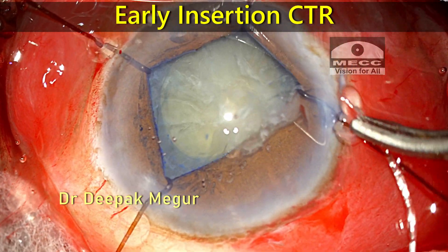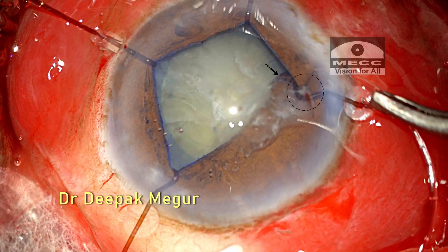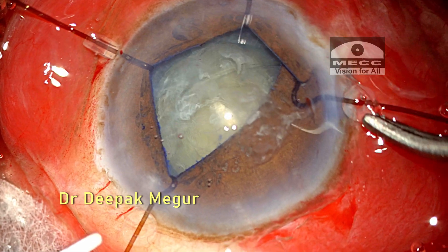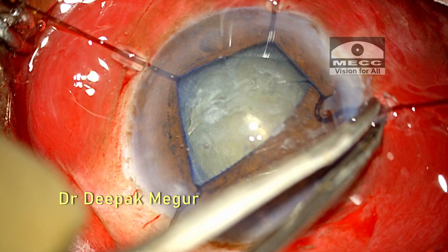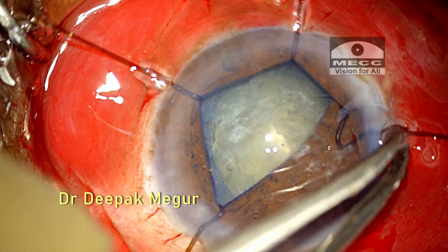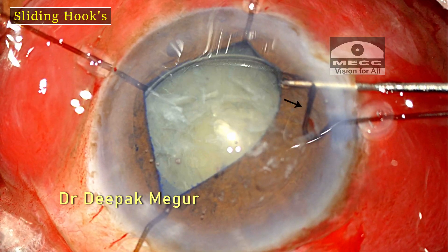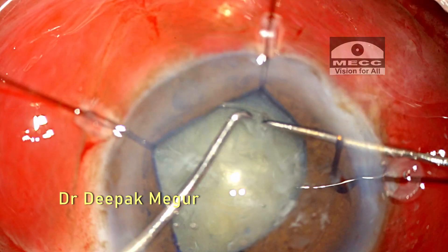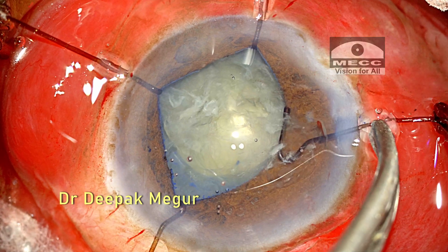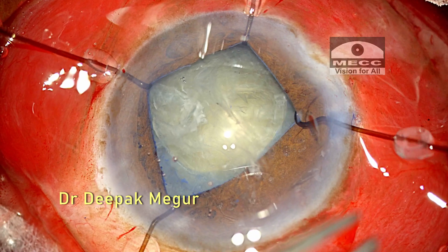I always prefer to insert the CTR as early as possible. During insertion it appears to have gotten entangled with a hook, and the hook gets dislodged from the pupillary margin. But eventually the CTR is threaded into the bag.